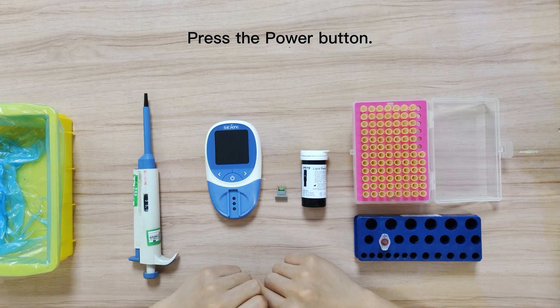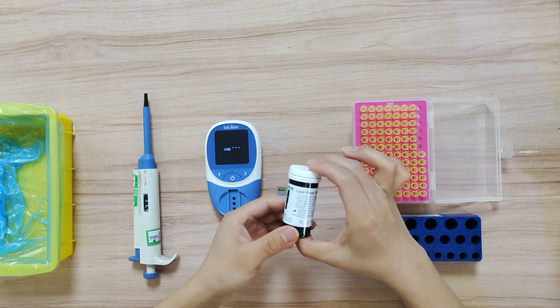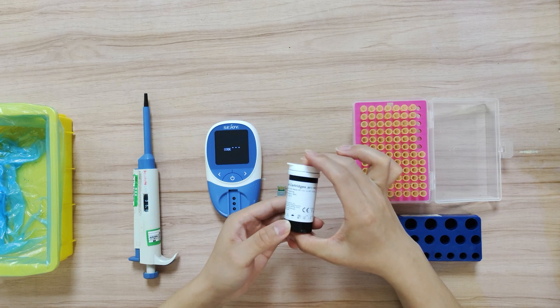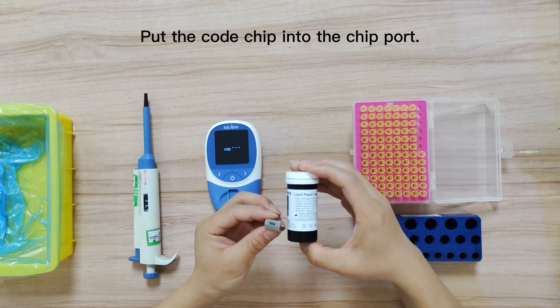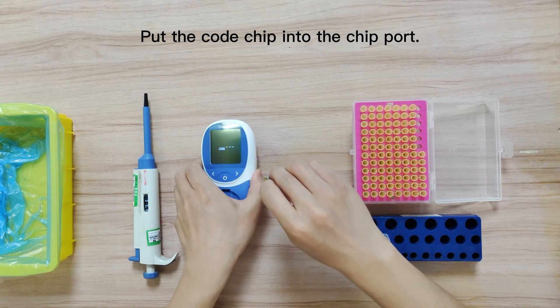Press the power button to display all LCD symbols. Check the code numbers on the bottle before inserting the test cartridge, and put the code chip into the chip port.